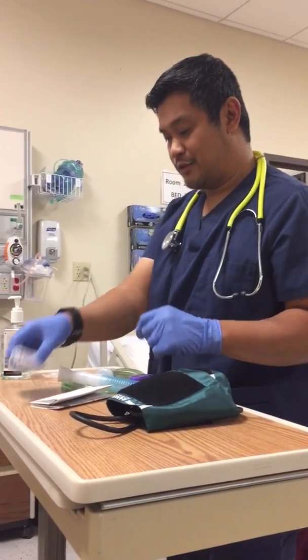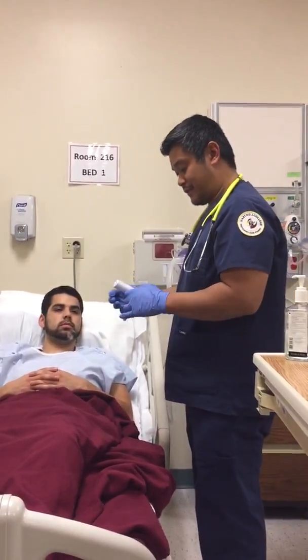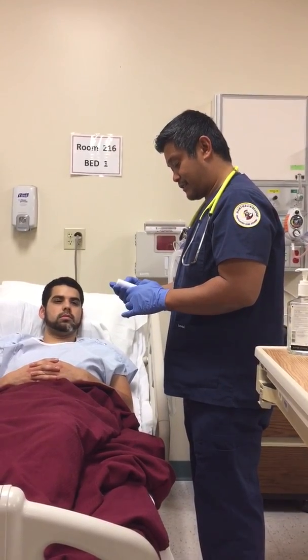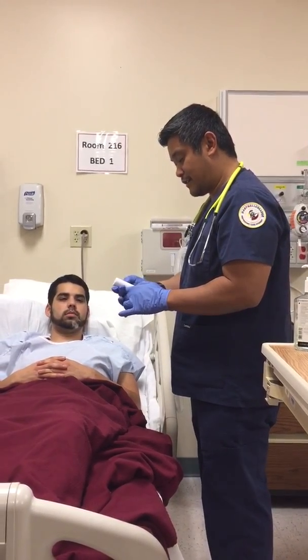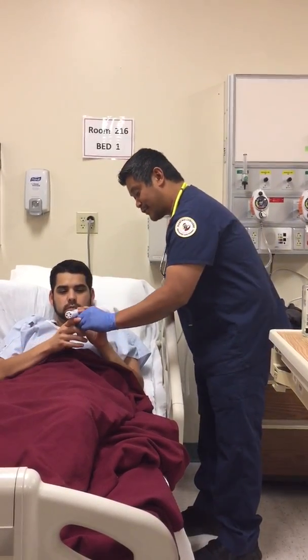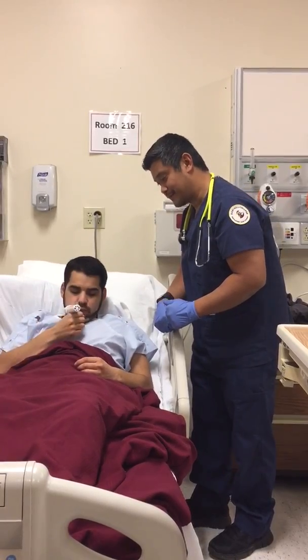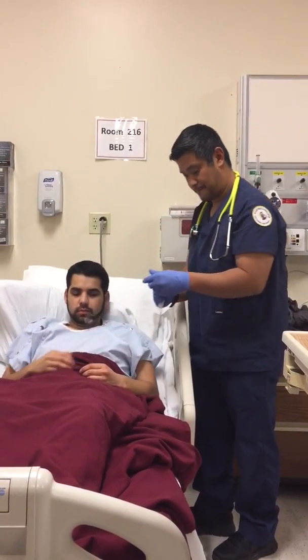All right, last thing we need to do, we're going to do another peak flow. So we still have your setting there at 600. Just go ahead and blow as hard as you can. It's like blowing out a candle. We do this 3 times once a week, okay? So go ahead and take a deep breath in. Blow. All right, good job.